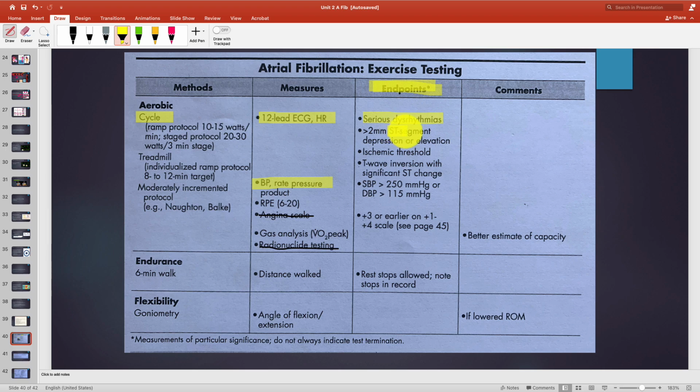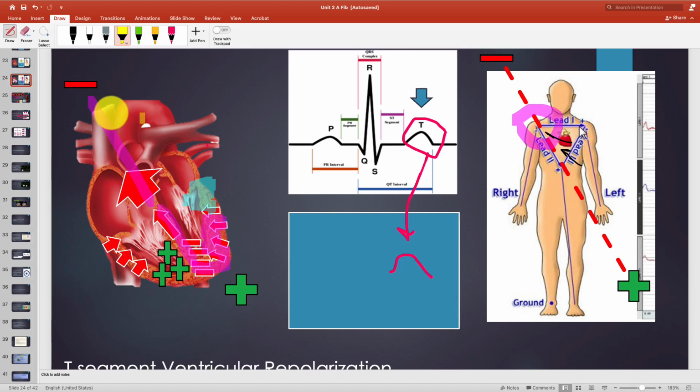We're going to look at changes in the ST segment. Now, we're not in the lab, so it's really hard to show you some of these things, but I will provide you with another small article talking about that. I don't want to do it today because I'm just bombarding you with so much information.